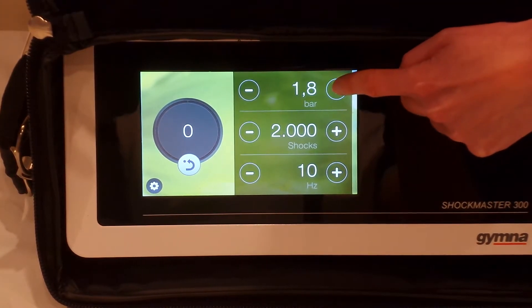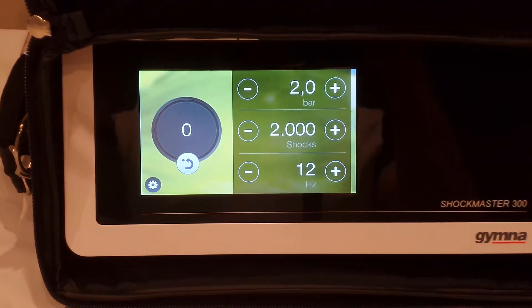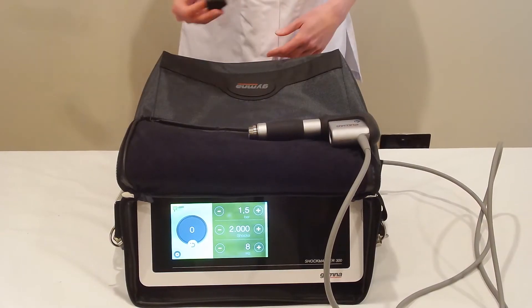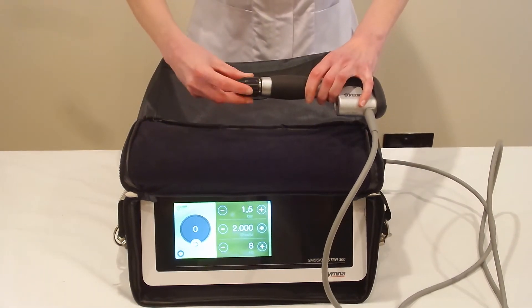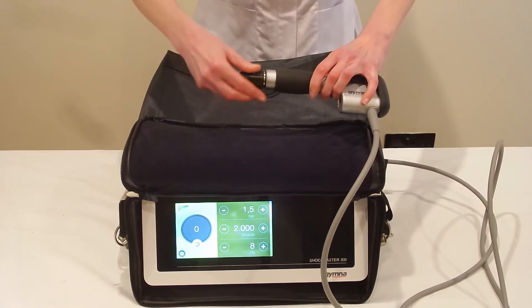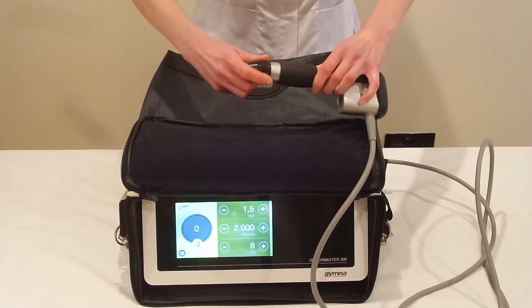In this video we'll be doing trigger point therapy to the hamstrings. We're going to go to two bar at 12 Hertz, and we're going to use a 15 millimeter convex head. In this case we're going to be doing trigger point therapy onto bicep femoris on the outside of the right thigh.